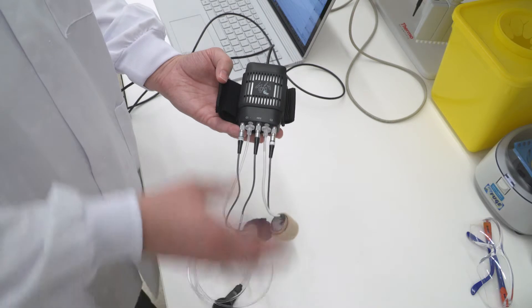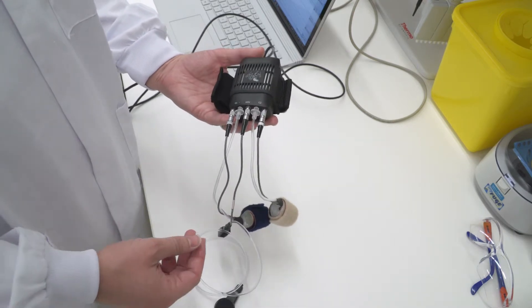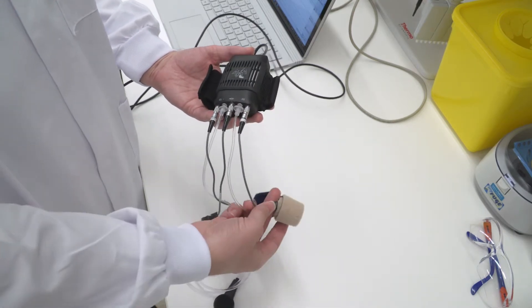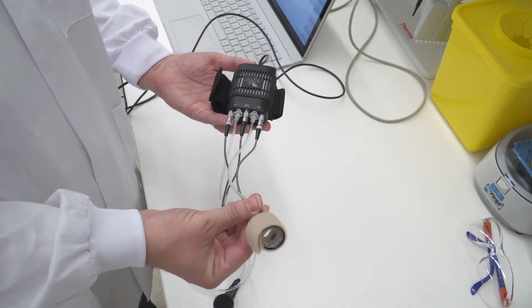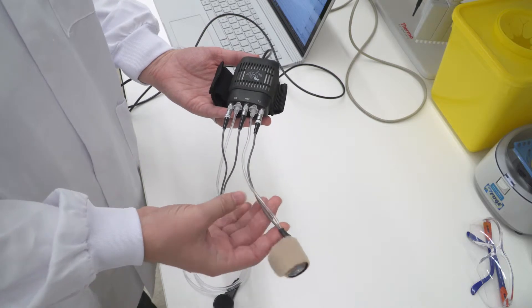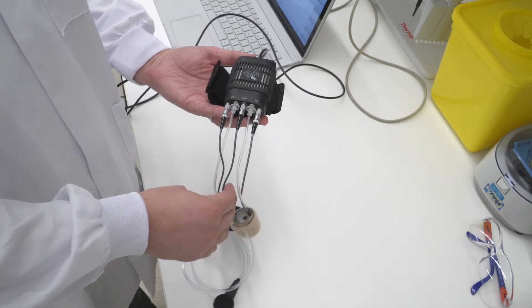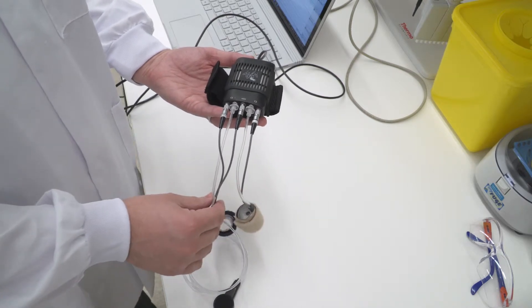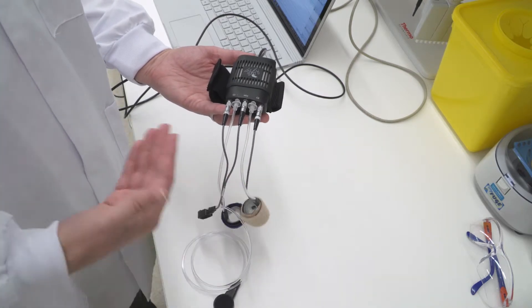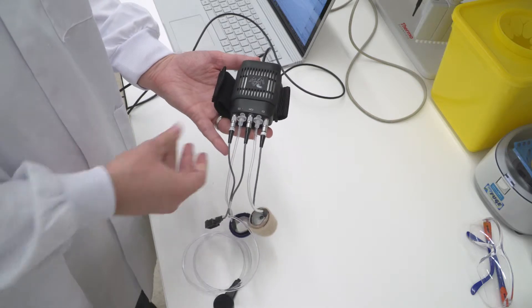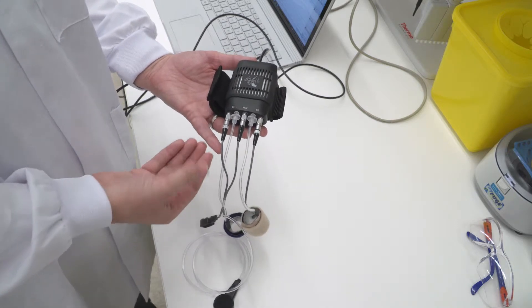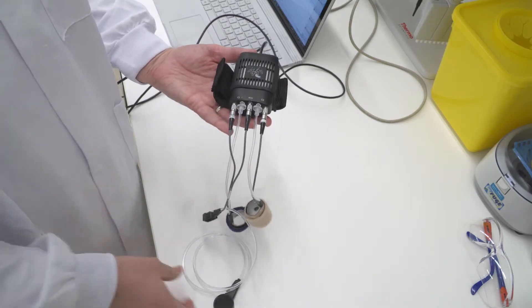There's the main wrist unit that you can see here, as well as two finger cuffs, which are available in three different sizes. The system uses two finger cuffs so that it can switch between those two to avoid cutting off the circulation to one finger for too long.